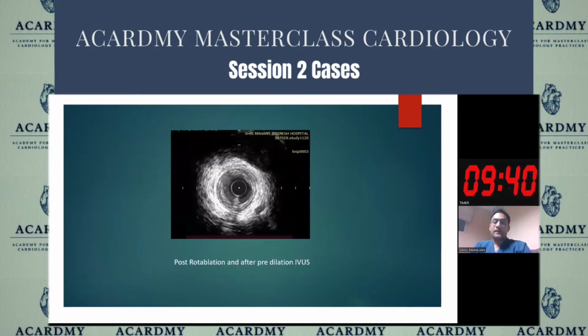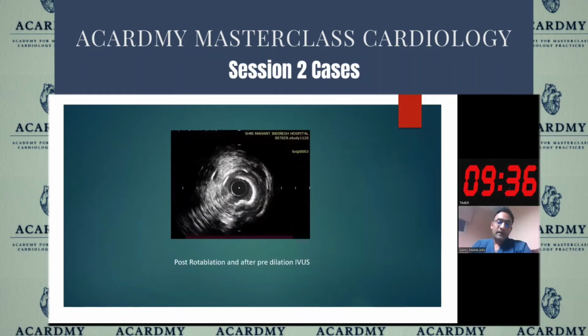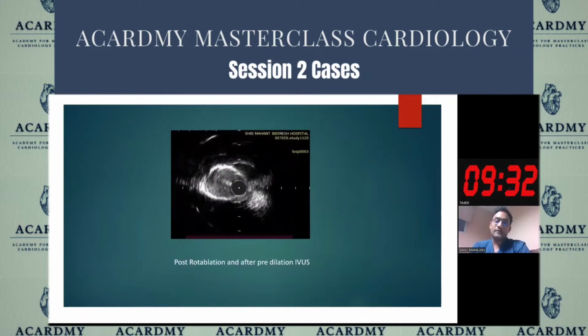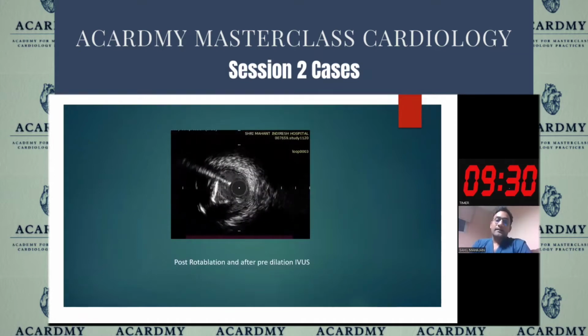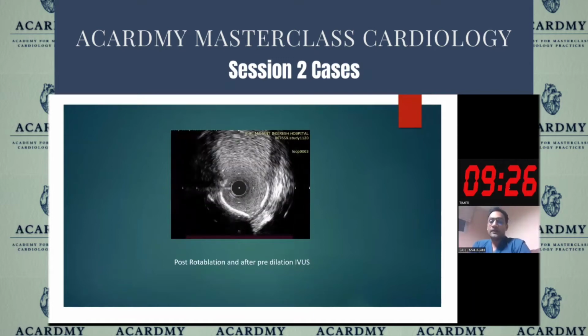After that, we did an IVUS for this patient. We can see a fibrous plaque in the mid distal LAD. As we come towards the mid LAD, we can see a dense 360-degree arc of superficial calcium there. This extended till the proximal part of the LAD, and there was some component going into the distal left main also.